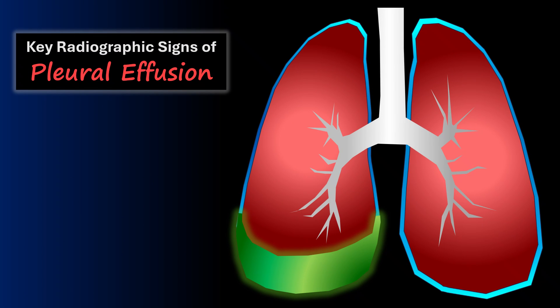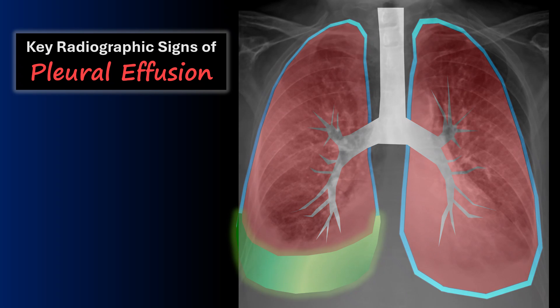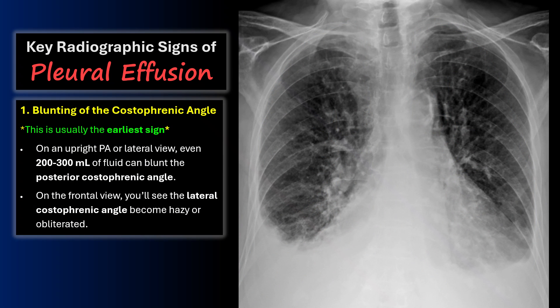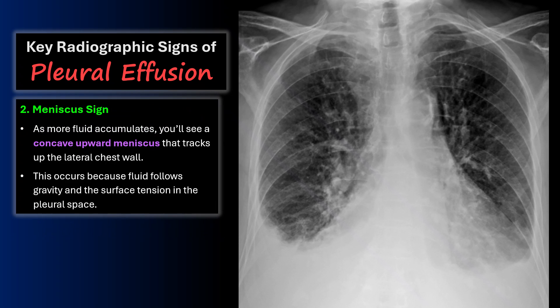Now let's look at the key radiographic signs of a pleural effusion. The first thing I'm looking for on an x-ray is blunting of the costophrenic angle — this is usually the earliest sign. Even 200 to 300 milliliters of fluid could blunt the posterior costophrenic angle, and on the frontal view you'll see the lateral costophrenic angle become hazy or obliterated.